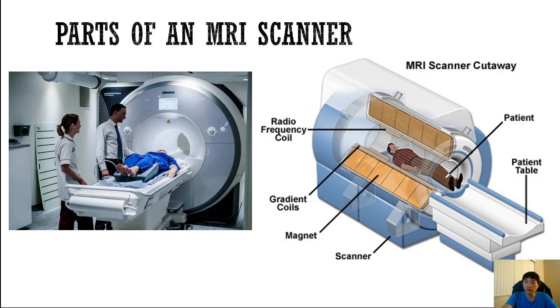So what gradient coils do is they create an imbalance in the magnetic field, and this gives us spatial information, because if the magnetic field is the same everywhere inside the magnet, including everywhere throughout our object, then you don't really get any spatial information. So if we make the magnetic field inhomogeneous in a controlled way, for example, we can have a linear ramp where the left side of the object can experience a slightly lower magnetic field than the right side of the object.